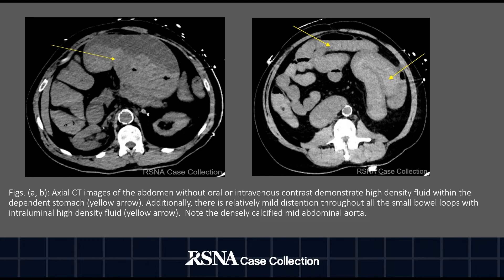Axial CT images of the abdomen without oral or IV contrast demonstrate high density fluid within the dependent stomach, as demonstrated by the yellow arrows. Mild distension can be seen throughout the small bowel loops on the right side of the screen. Also note the densely calcified mid-abdominal aorta.